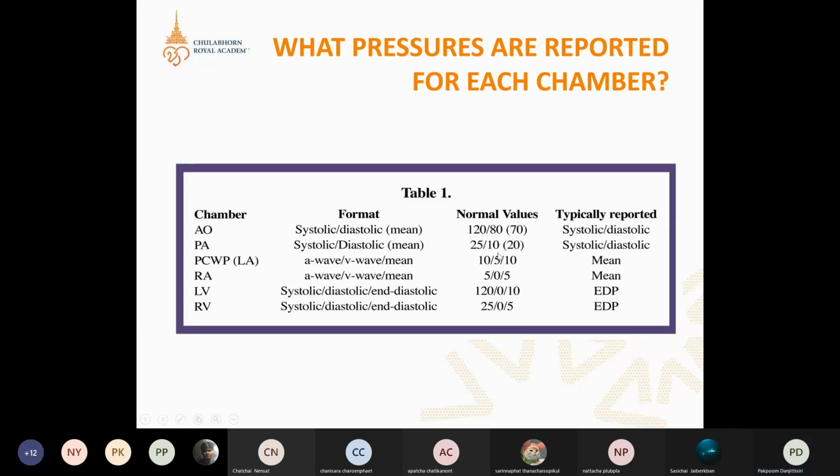It will definitely help you to diagnose more easily when you work as a monitor in a laboratory, to see the different or abnormal pressure in real time.